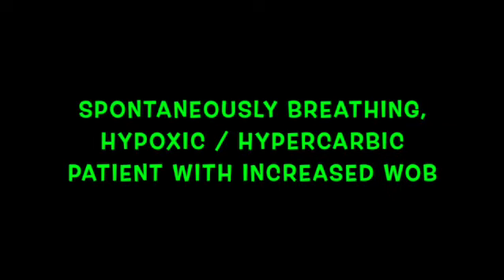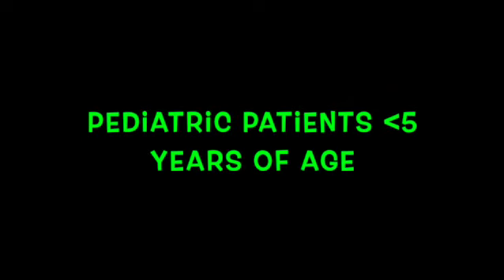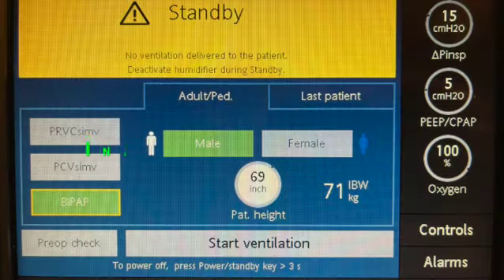circuit. Non-invasive support is indicated for use in spontaneously breathing, hypoxic and/or hypercarbic patients with increased work of breathing or other signs of respiratory distress. Contraindicated in any patient with signs and symptoms of immediate respiratory failure, patients that are unable to follow commands, loss of respiratory drive, and pediatric patients under 5 years of age.